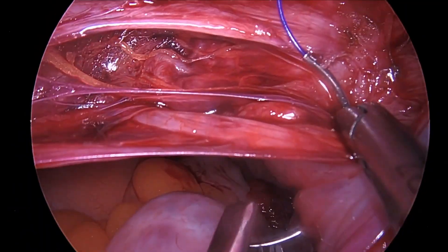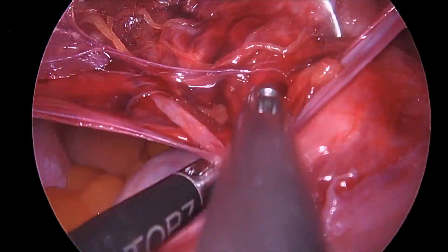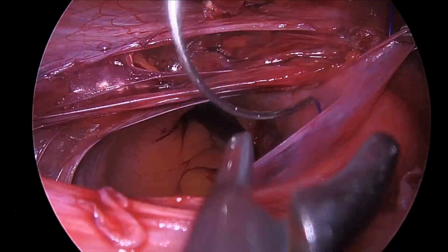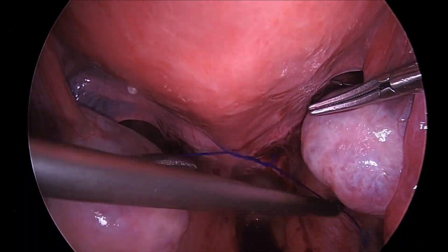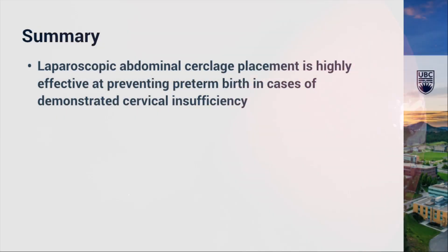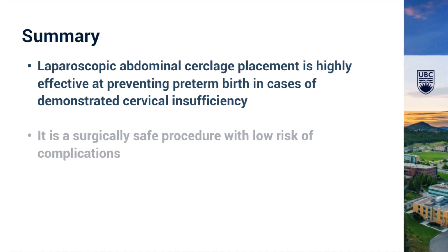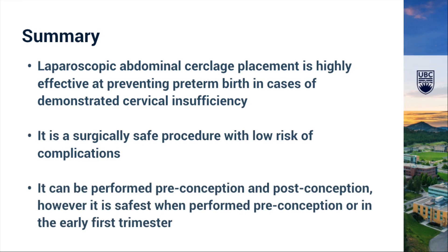Tying the suture posteriorly allows for ease of suture removal with a posterior colpotomy in the event that the uterus requires evacuation, for example in second trimester pregnancy loss. In summary, laparoscopic abdominal cerclage placement is highly effective at preventing preterm birth in cases of demonstrated cervical insufficiency. It is a surgically safe procedure with a low risk of complications and it can be performed pre-conception and post-conception. However, it is safest when performed pre-conception or in the early first trimester.